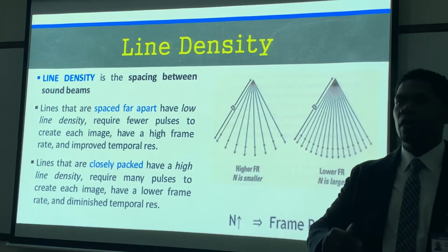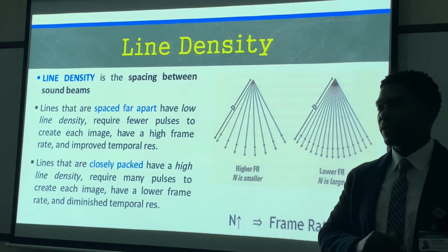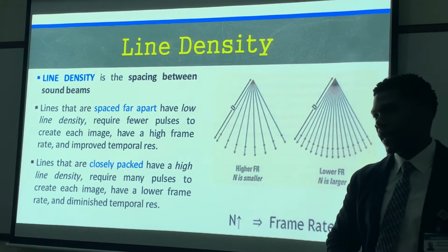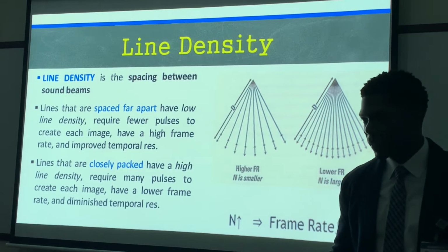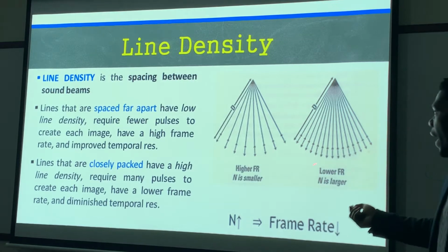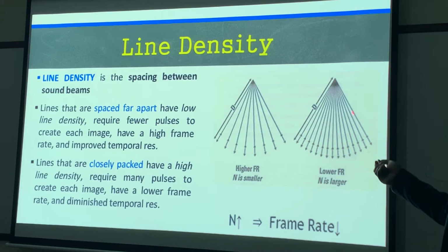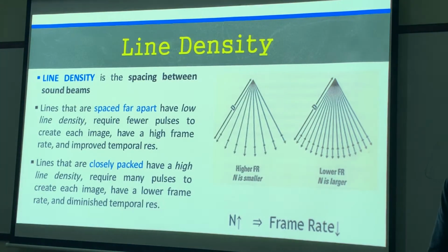Instead of cross-sectioning the body at the heart, now I'm cross-sectioning the body at the liver. Now I'm doing it at the umbilicus. Now I'm doing it at the waist. I'm getting more slices now. I'm getting more accurate information now because I'm sending out more scan lines. So that's going to improve my image detail. I hope that was a good analogy.